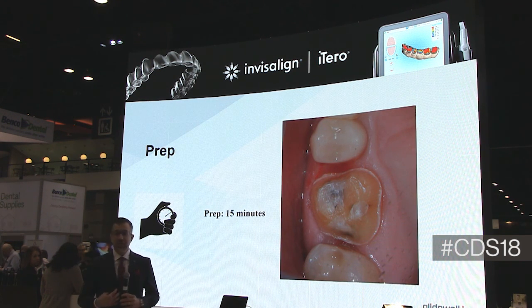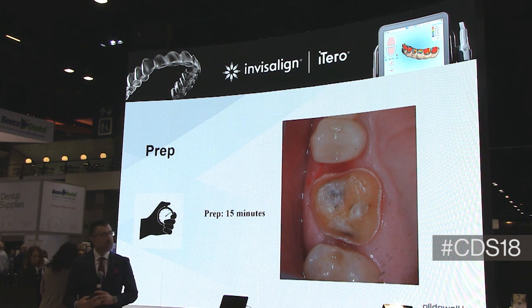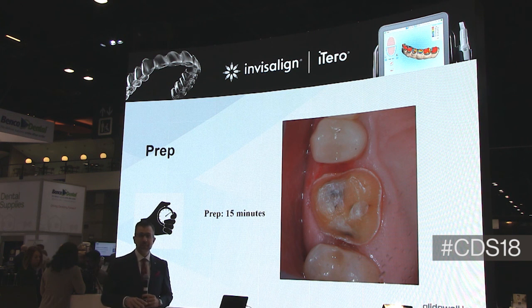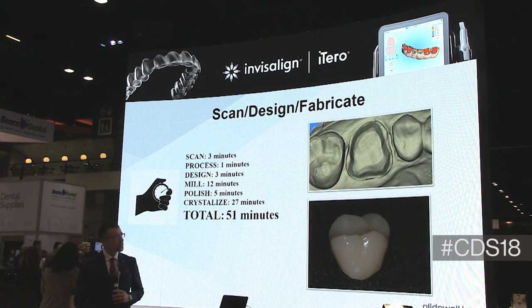Prep design to me is very important. However, for the three materials that I presented, for all of my preps, a chamfer is adequate, and I think a chamfer provides the best visualization on a digital impression. So I do all of my preps with a full chamfer.